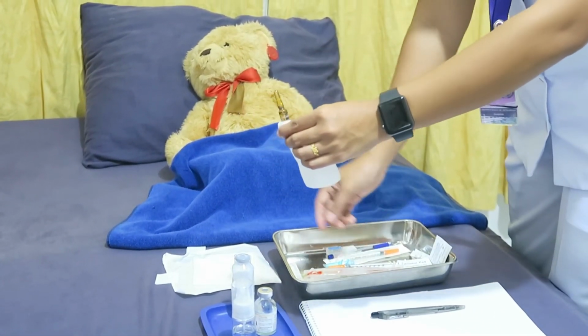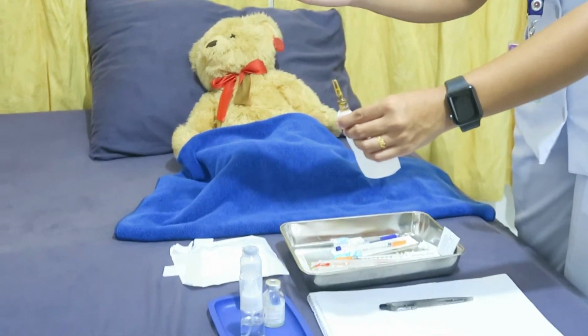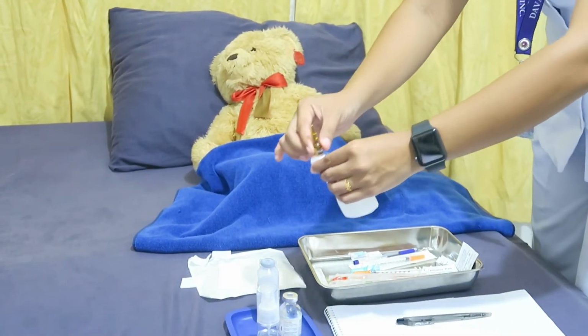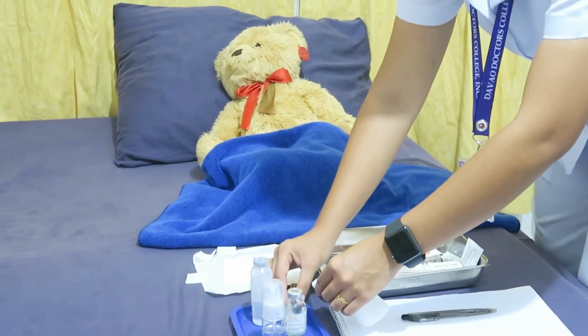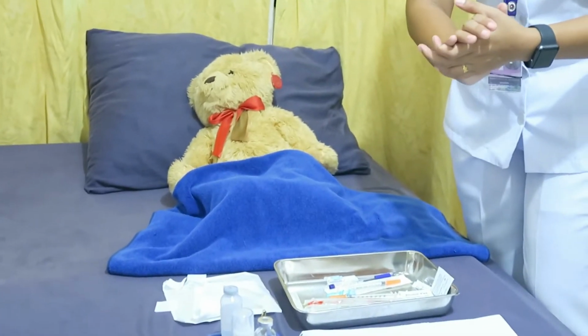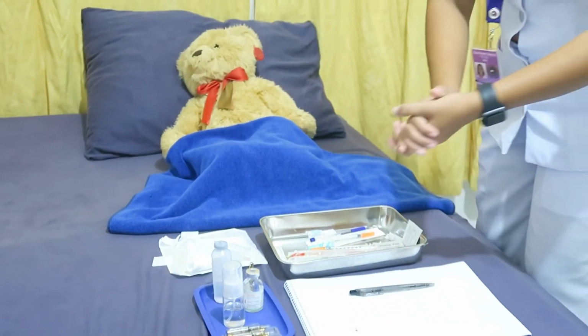Then, after that, withdraw the medication. So, first is to place the ampule on a flat surface, and then attach the filter needle straw to the syringe.